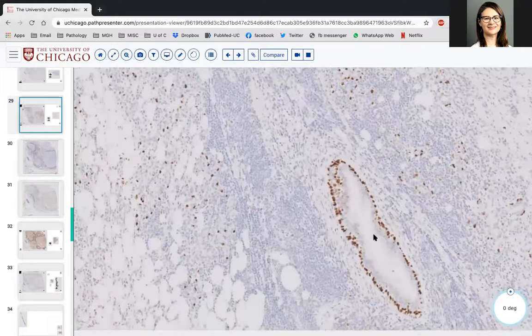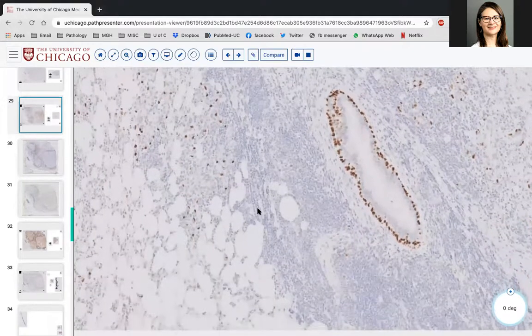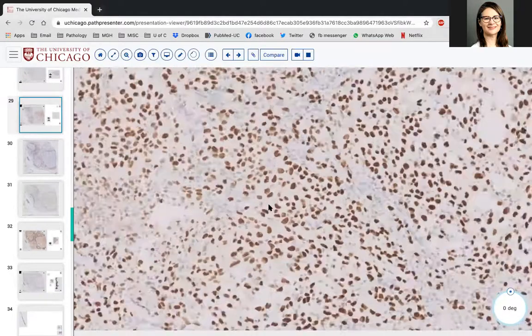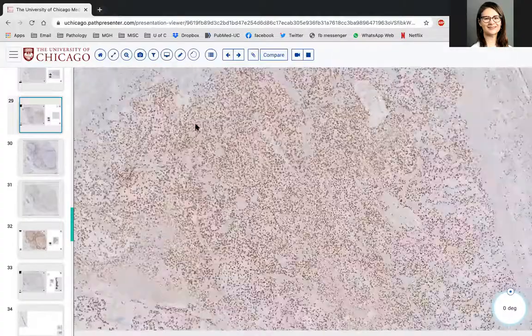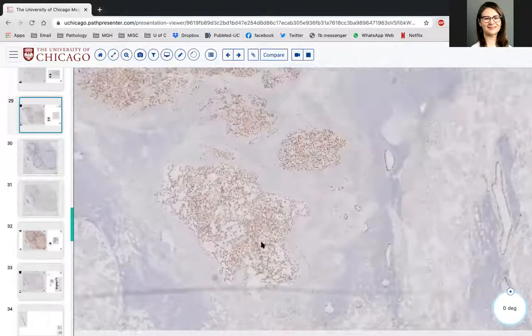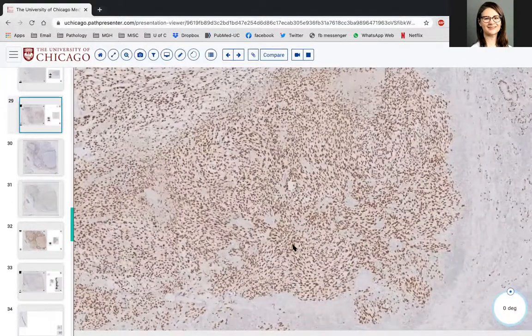As we know, just as a reminder, P63 can be positive in polymorphous, even though P40 is negative. In most other tumors, it functions identically. As in this case, it essentially functions identically, with P63 being somewhat stronger. Excellent. What else do you want? And what are you thinking with these being positive?